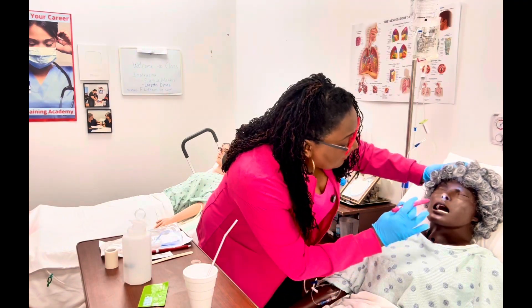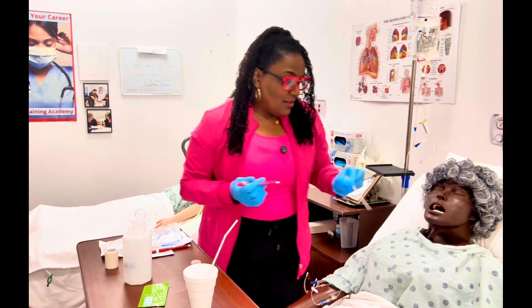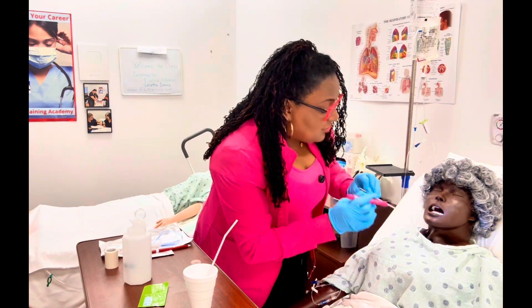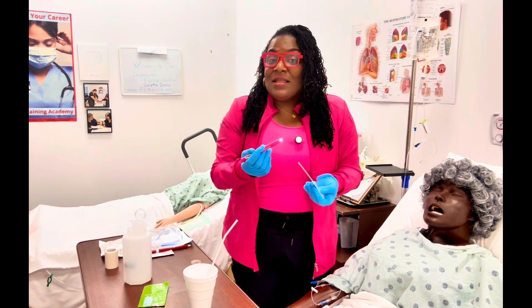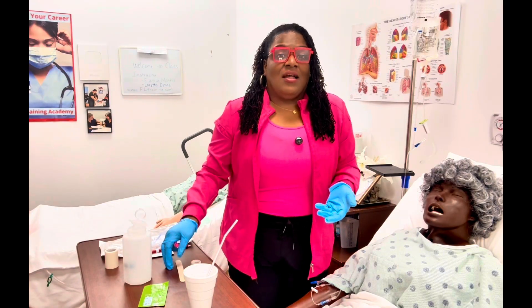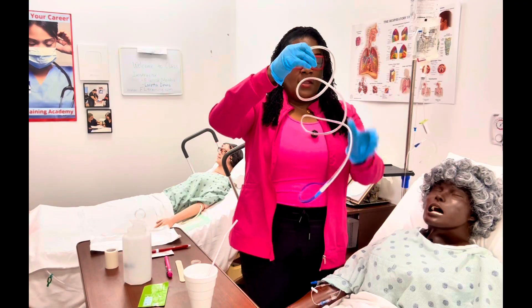Let's go ahead and inspect. I'm going to use my penlight — Mrs. Lucas, I'm going to be looking at your nostrils. I don't see anything. I'm also going to look in the back of her throat, because as the tube advances sometimes the patient starts to cough and gag. I'm not going to put this too far in, just enough to visualize the back of the throat. Her nostrils look okay, the back of her throat looks okay, and she had a gag reflex.